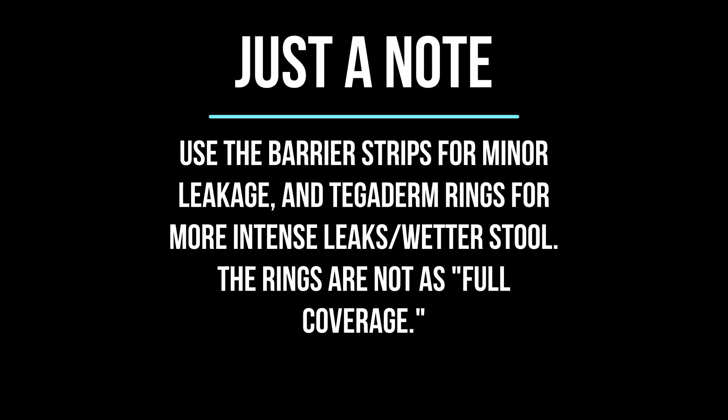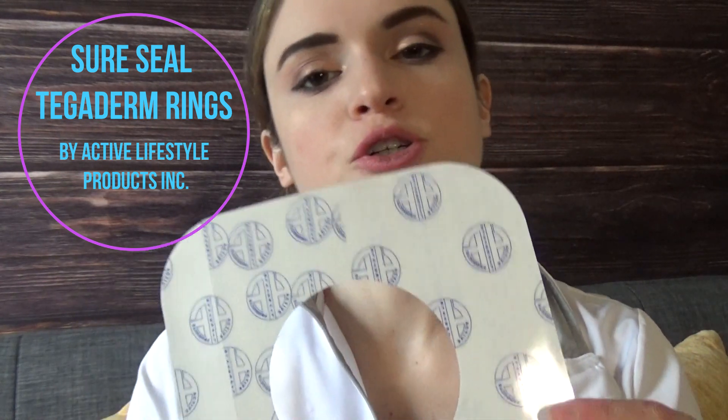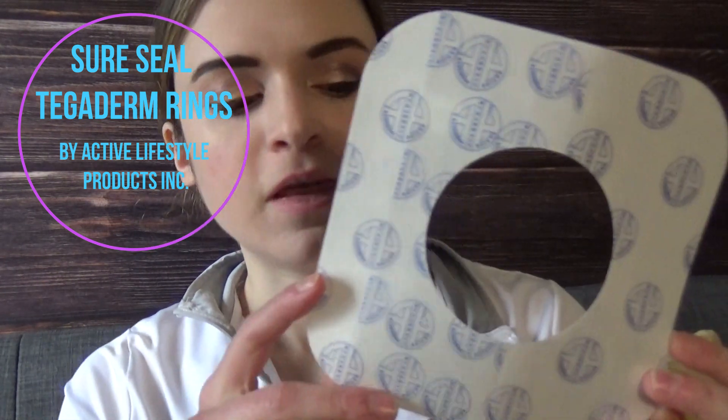These are the Active Lifestyle Products Sure Seal rings. I put them around the perimeter of the stoma or wafer just to ensure there is no leakage. They are extremely helpful, and I'll be showing later how I apply them once the bag is actually on.